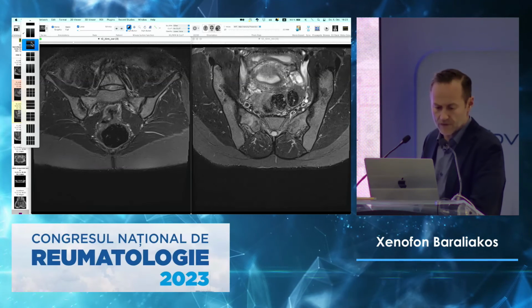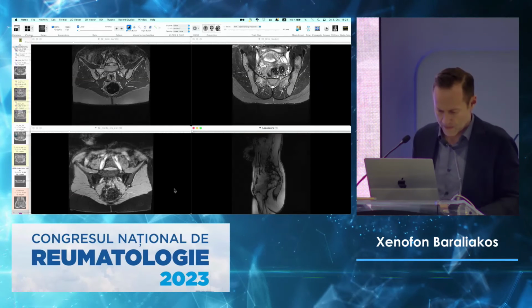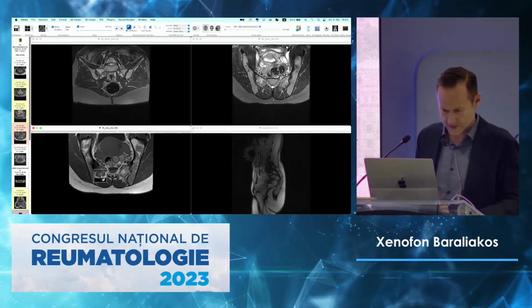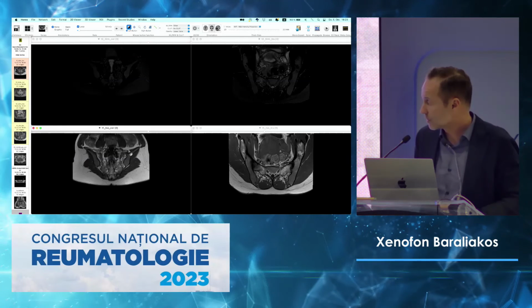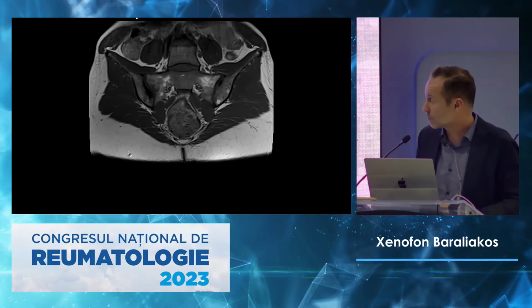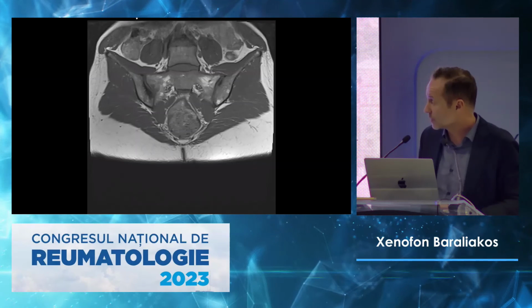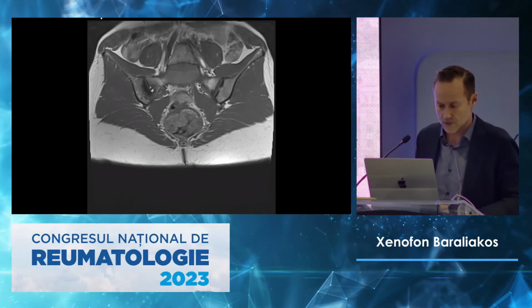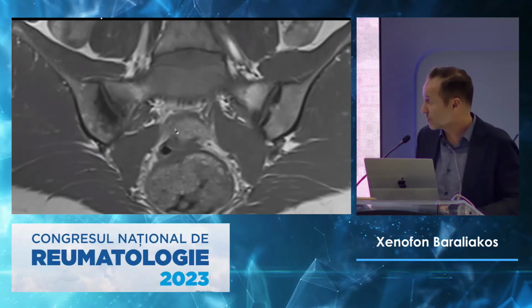If we look at the T1 images, one second, yeah, that's the T1 image. If we look at the T1 images, we will see that there is not really much of what I told you. Remember, the fat needs to be around the joint, not far away, and it needs to be more homogeneous, which is not here. And there is also sclerosis. And, importantly, the joint lines are very well preserved.